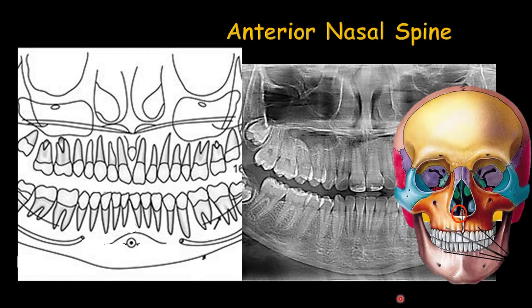Beneath the nasal septum, you can see the anterior nasal spine, which is a bony projection between the two parts of the maxilla where they join together. You can see it in this panoramic radiograph as an opaque bone with a roughly triangular shape.